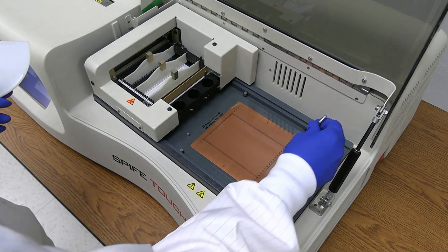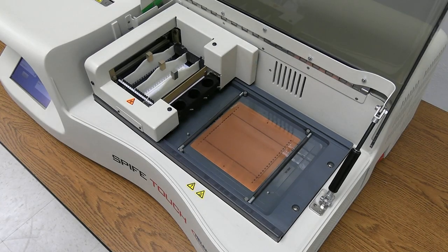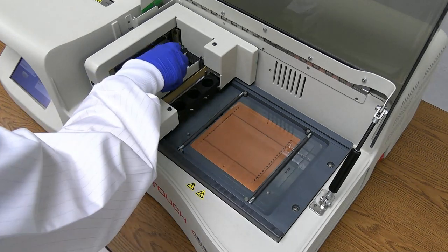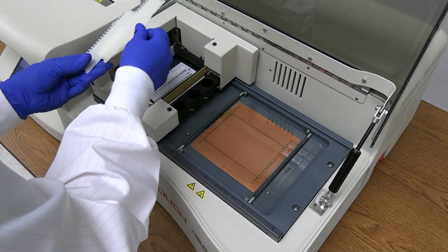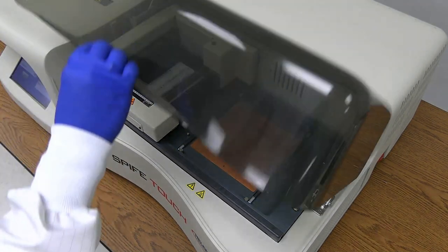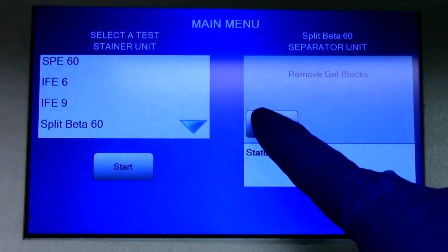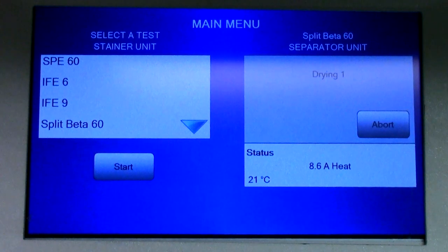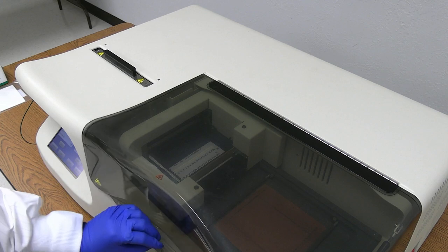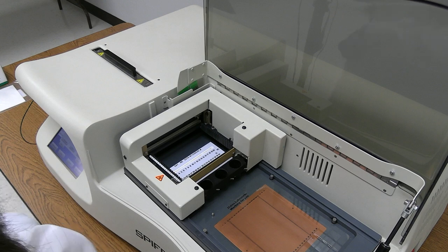Replace the electrodes on each end of the gel to prevent curling during drying. Dispose of blades and cups as biohazardous waste. Close the chamber lid and press the continue button to dry the gel. Once dried, you're ready to stain. Open the chamber lid and carefully remove the gel from the electrophoresis chamber.